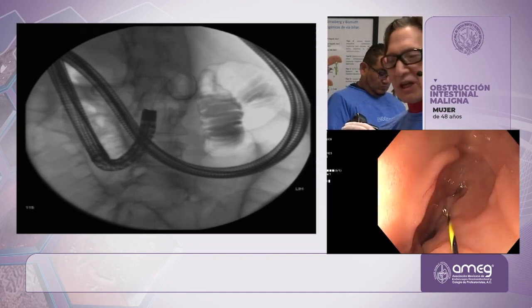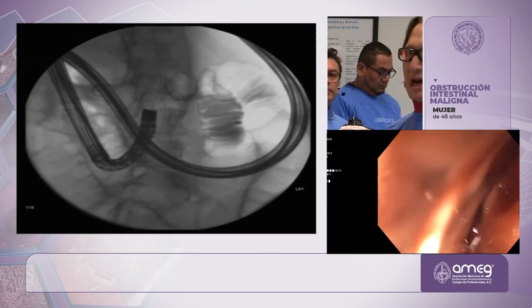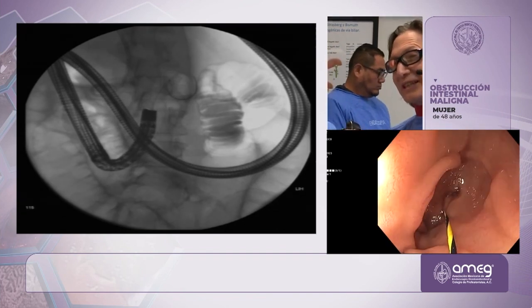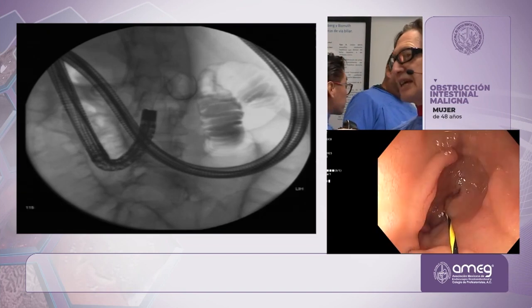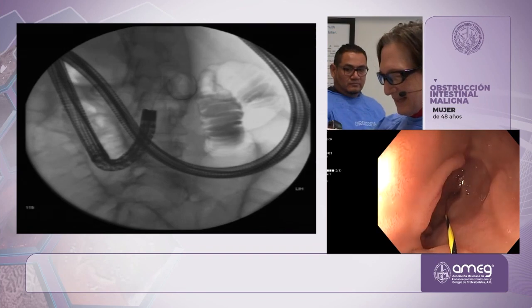And this is fine because we're going to be creating our anastomosis at the ligament of Treitz. We're not really doing a gastrojejunostomy. It's really more of a gastroduodenostomy, I think. But that's why I think the term gastroenterostomy is the best in terms of being anatomically correct.